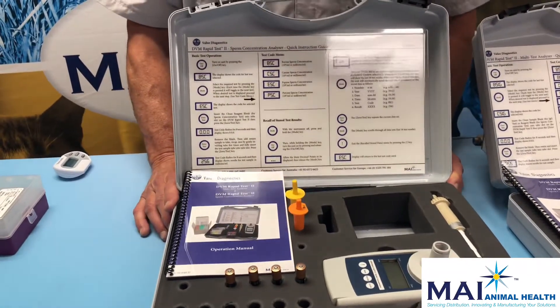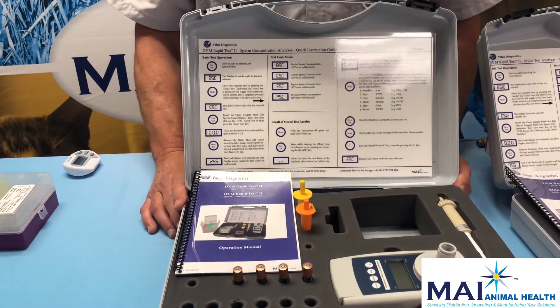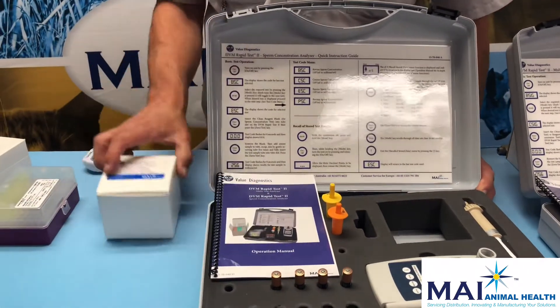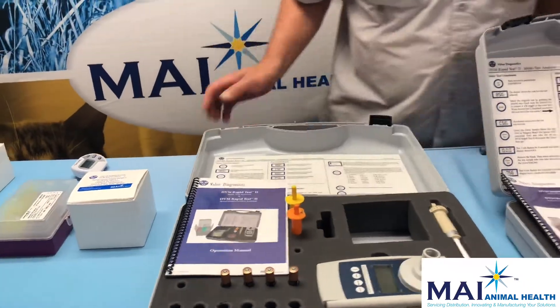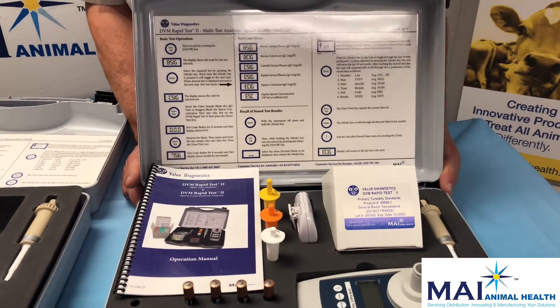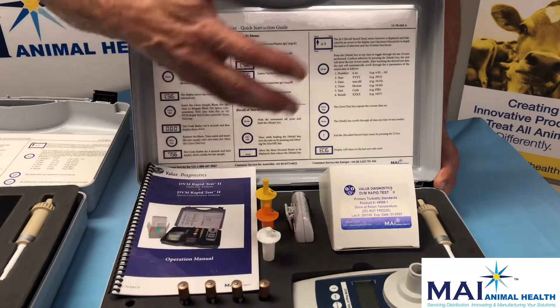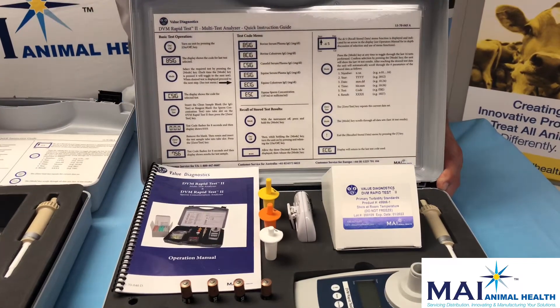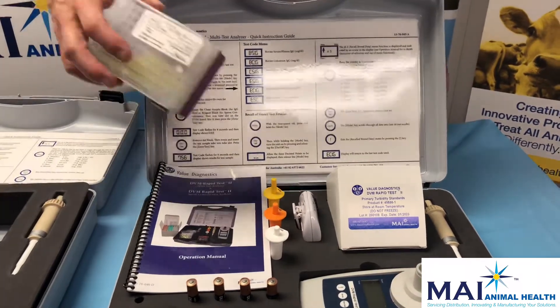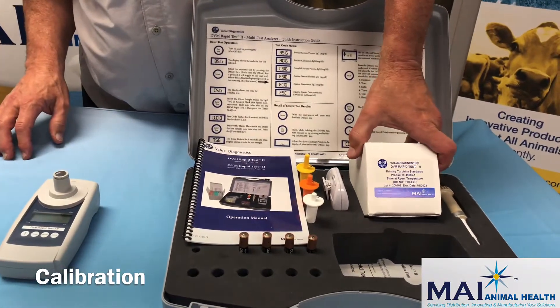Opening up your DVM rapid test instrument packages. The first package is the DVM rapid test sperm concentration unit. All the items needed to perform the test are included, other than the reagents and pipette tips, which you must purchase separately. The second unit is the DVM rapid test multi-test, which performs both IgG tests on serum and colostrum on several species, as well as sperm concentration for equine. Again, all items are included except additional reagents and pipette tips.